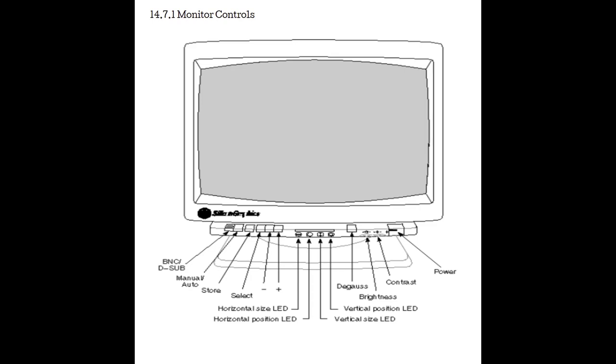Speaking of monitor technology, though, almost every single monitor, your TV, your computer monitors, your ultrasound screen monitors, are all going to have their own controls to adjust different settings. Remember that whatever you change on your monitor, on your machine, is only true for your monitor and for your machine. None of those changes are going to be reflected in your pictures because they are not connected to the image data information themselves. It is just what's on your machine.